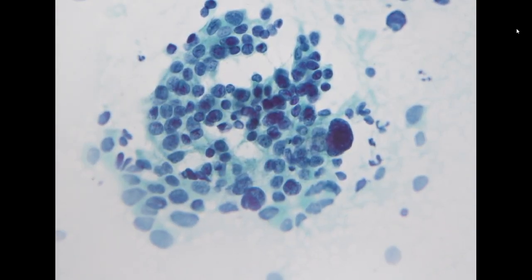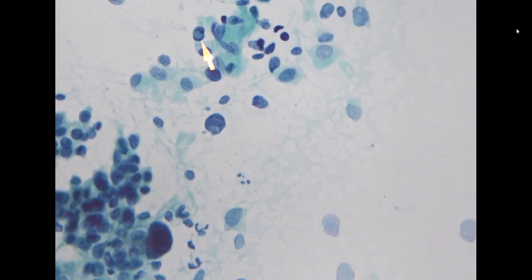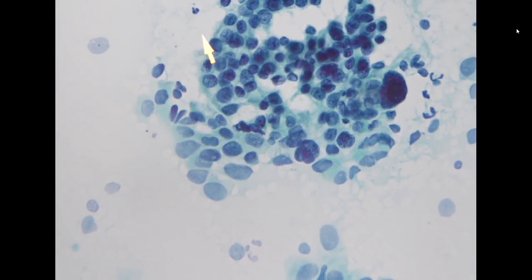So even though in this specimen there is no prominent nucleoli, the cells seem to be more hyperchromatic than usual. It's more hyperchromatic than a vesicular chromatin pattern. But because of the cellular arrangement, it still has glandular arrangement, and because we see pseudo-inclusions, there were actually a couple of them, we call these adenocarcinoma. We can also call this non-small cell in favor of adeno. But because the patient already had a TTF1 positive pleural effusion, we call this adenocarcinoma.